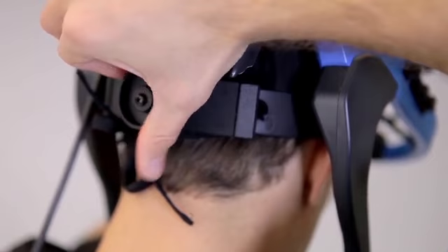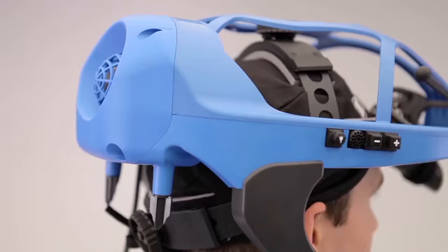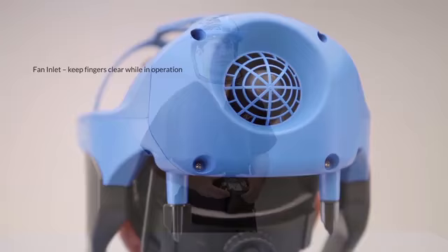Connect the helmet power cable to the battery holster. Insert a fully charged Total Shield Rechargeable Lithium-Ion Battery into the battery holster. The helmet fan will automatically begin operating at fan speed 1. Do not place fingers on the fan inlet while the fan is in operation. Now fasten the battery holster on your waist.